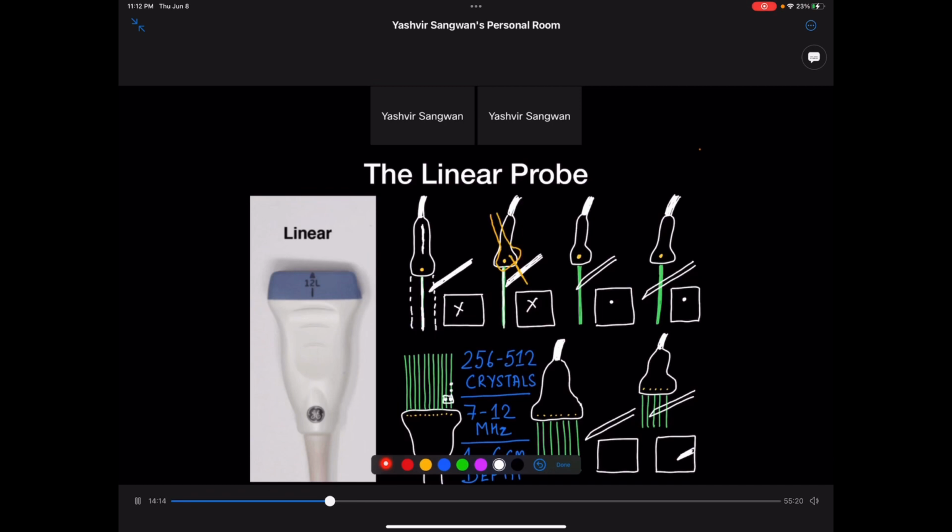Now, at this point, the needle has actually crossed the center line of your ultrasound probe, and sound waves come down and get reflected back, and you see a point. If the needle crosses this line, you will still only see a point. Why? Because the ultrasound will only register images along this beam of a width of approximately a credit card.